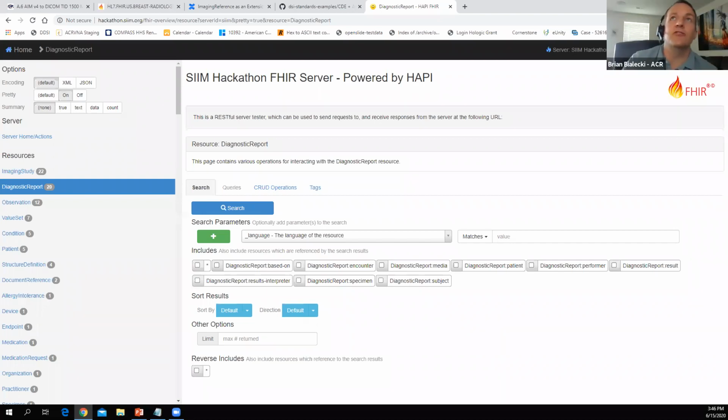So these can definitely transfer to whole slide imaging. The way that they were defined was with the DICOM standard, at least as a backbone for this. And today, these same annotations for whole slide imaging are part of another DICOM working group, but we're making sure that they were not specifically tied directly to radiology only images, but could also be transferred to pathology images or any other context.